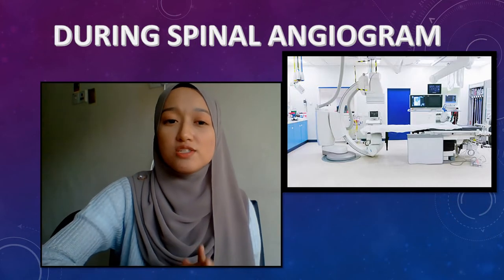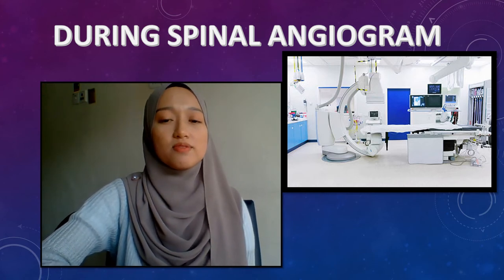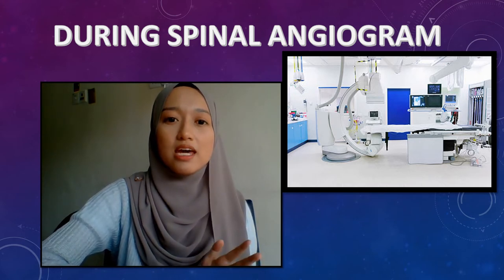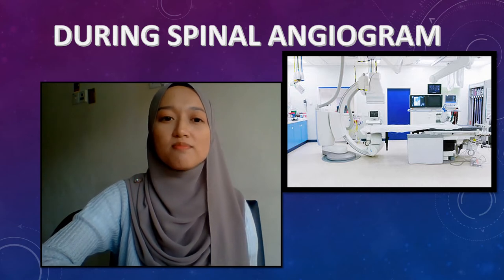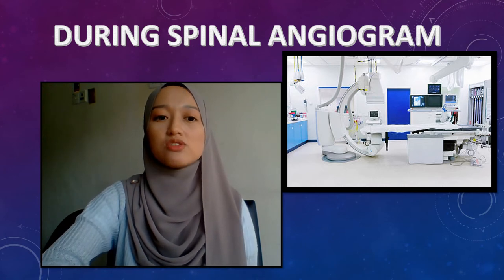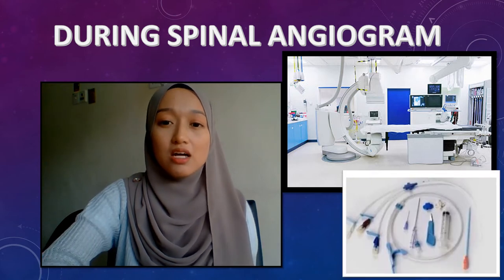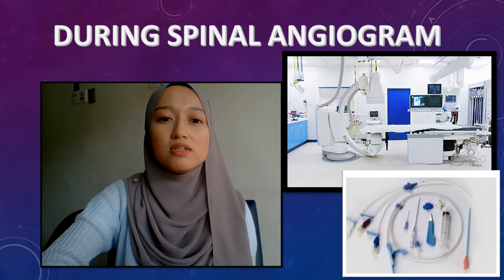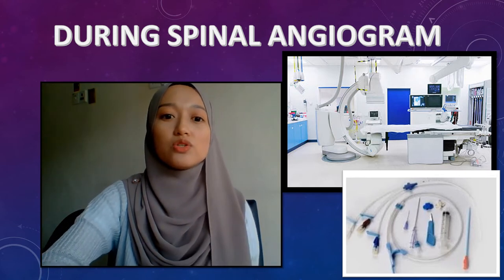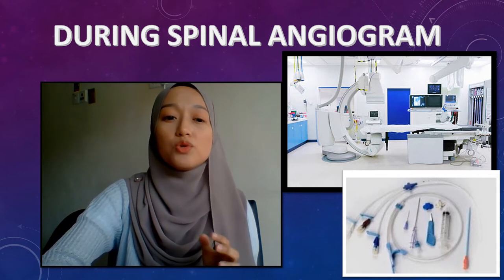Okay, what can you expect during a spinal angiogram? Spinal angiography is typically performed under light sedation. Some people may require general anesthesia, often due to a separate medical condition. Before the procedure begins, you will receive pain medication through an intravenous line. Spinal angiography uses a catheter, a thin, bendable tube, to deliver contrast medium or dye into your body. This dye allows your doctor to see the blood vessels, arteries, and veins during the procedure.